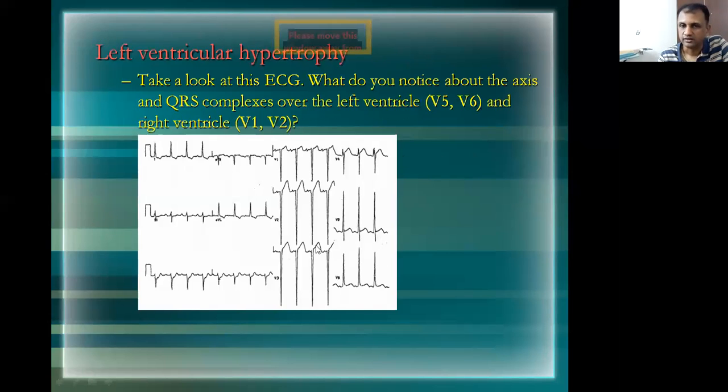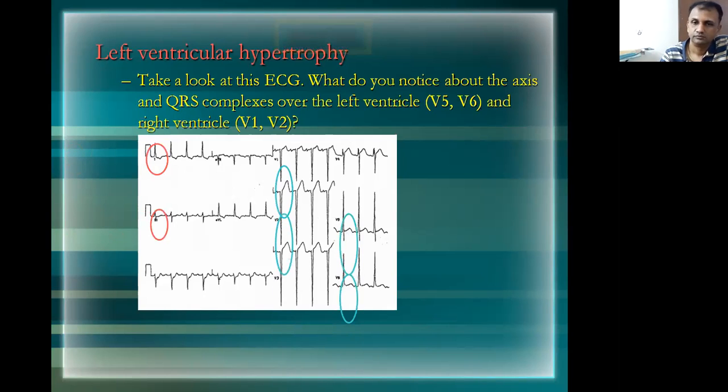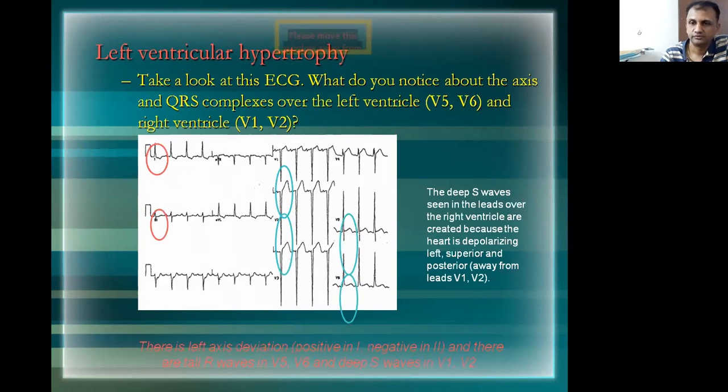Another thing: sometimes because of severe left ventricular hypertrophy, you could have some slight ST depression on the ECG. That's called a ventricular strain, left ventricular strain pattern, because muscles are very thick and the heart is struggling to pump against the thick muscles to supply blood to the coronary and the myocardium. Yeah, that's the one we discussed.